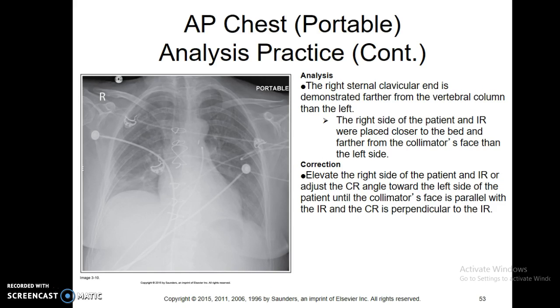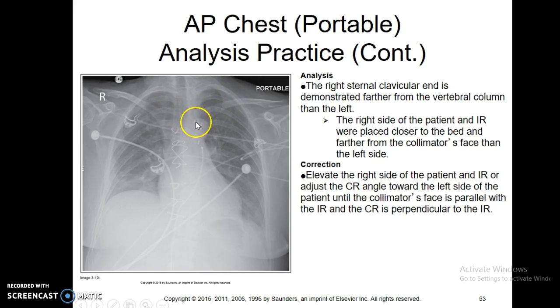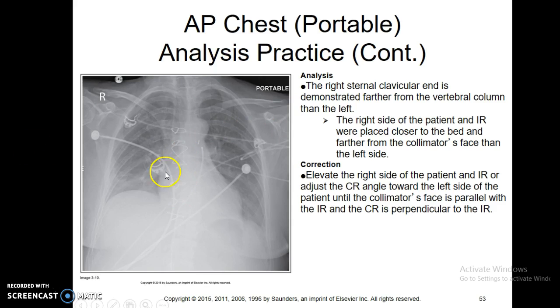On this image the right sternal clavicular end is demonstrated farther from the vertebral than the left, so you've got one end over here and the other kind of crossing over towards the edge, which means the patient is slightly oblique. You want to correct that as much as possible so you're getting a straight-on view and not pushing the heart towards one side more than the other.